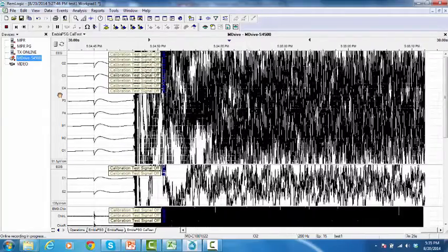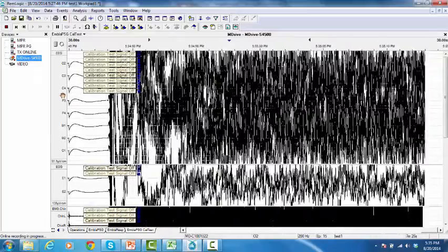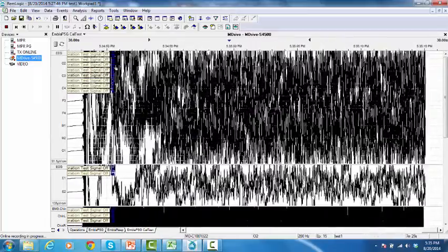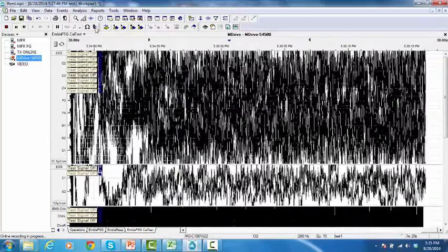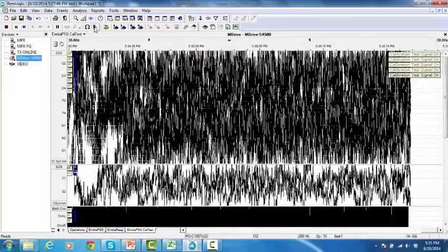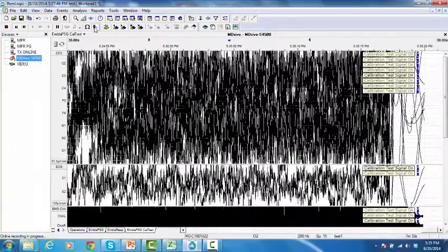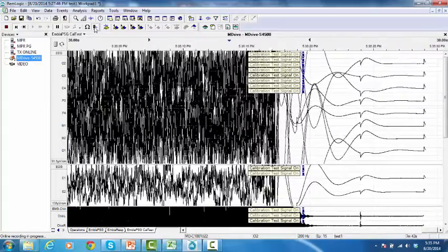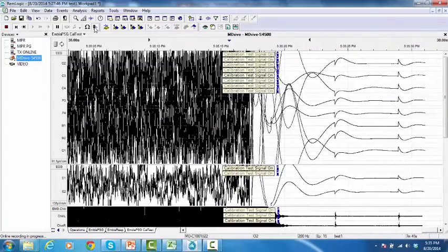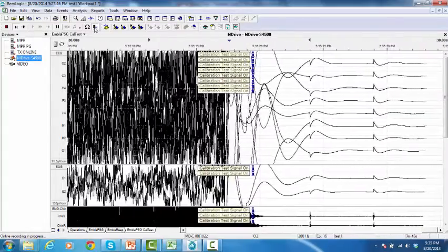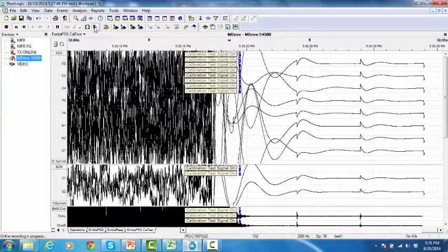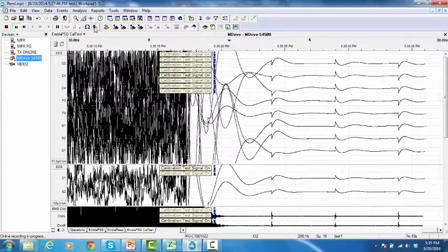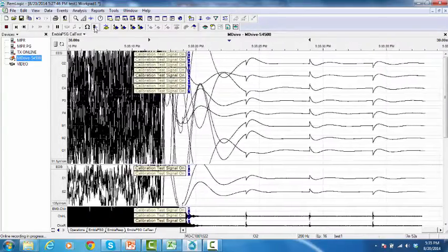The second approach is to click Calibration Test Signal in the Controls toolbar. And to stop the calibration signal, click on the Calibration Test Signal in the Controls toolbar.